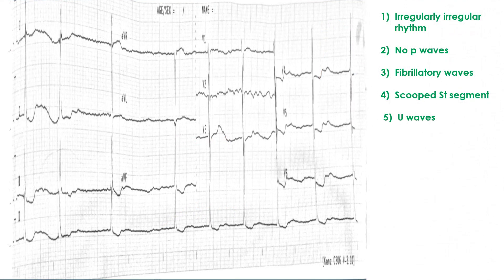Summarizing what we have identified so far: an irregularly irregular rhythm, no P waves, fibrillatory waves of atrial fibrillation, an ST segment that is scalloped or scooped, and U waves.